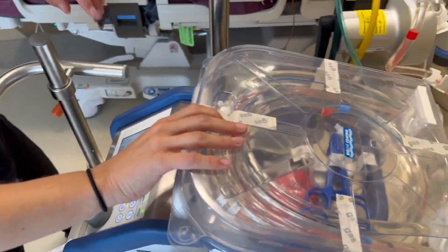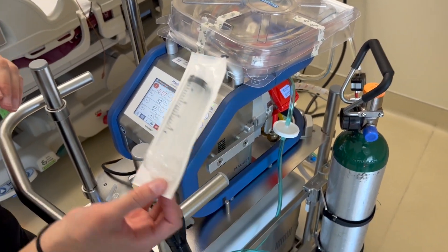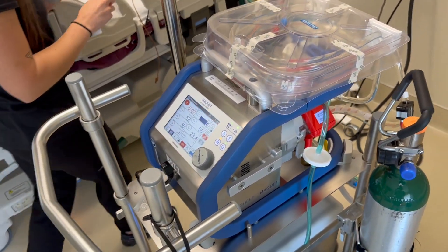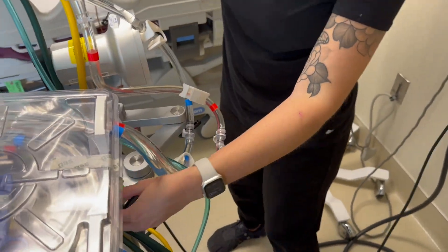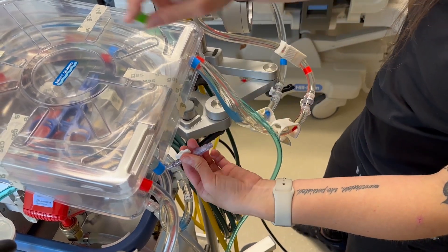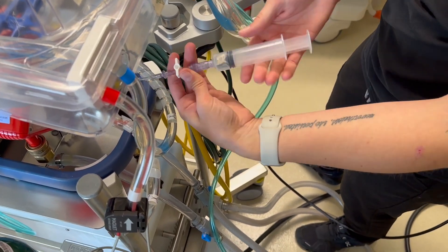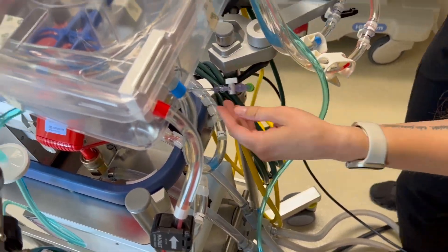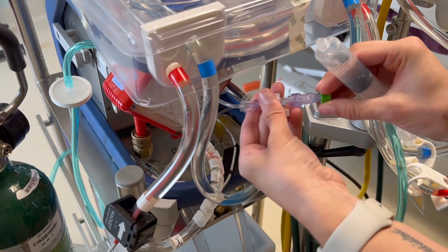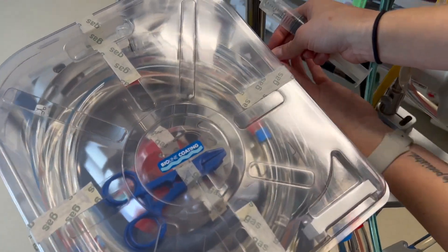Once the oxygenator is full, take a new syringe and prime all of your pigtails. Remember the claves were placed on these during setup and there should always be a green cap on. Take the green cap off, attach your syringe, and prime. Do each one of your pigtails — all three of them. That last one can be hard to find; it may have got stuck underneath your circuit.